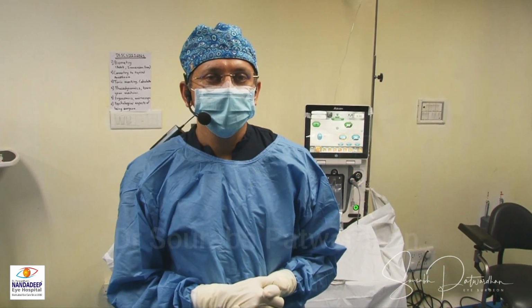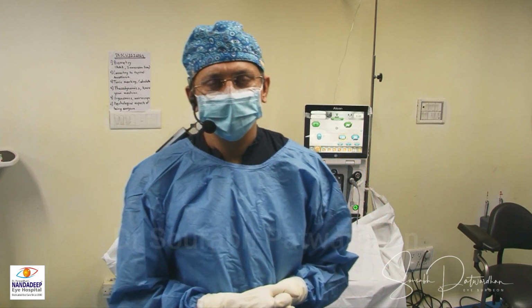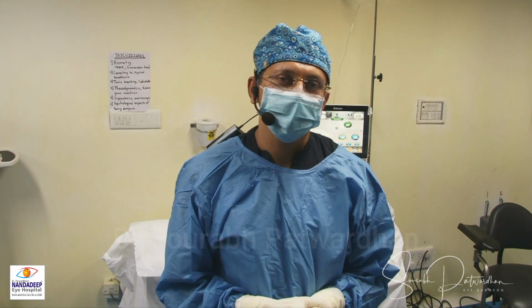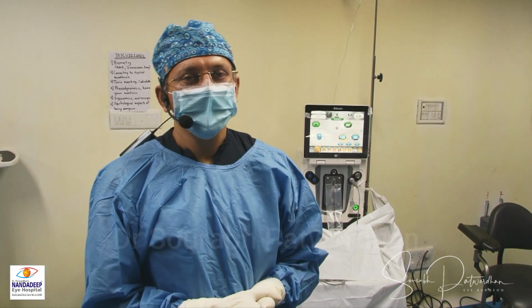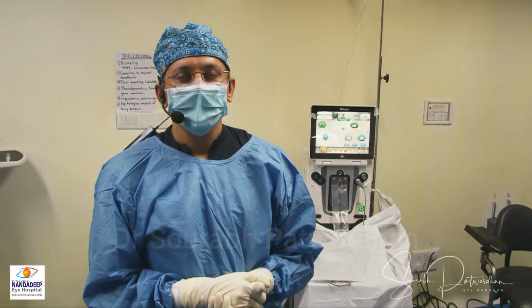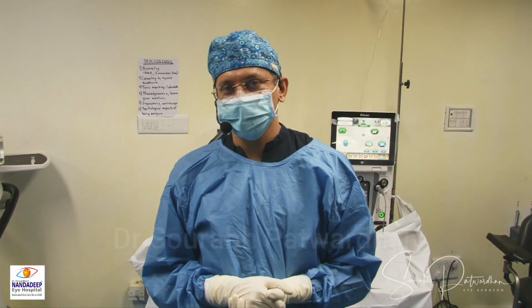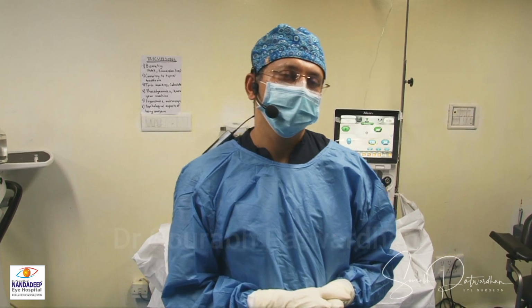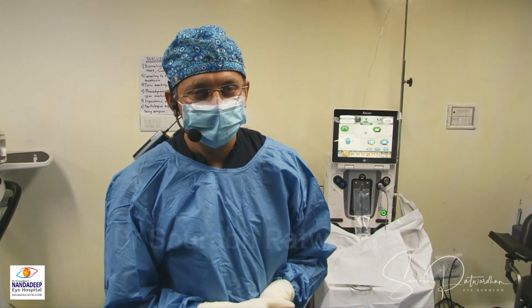It's developed by me, and instead of the usual slit lamp marking or bubble marking, we can use this app very easily in your OT just before the surgery to get the accurate reading. I also have the Callisto markerless system, so we'll also see how much error this has against Callisto, which is more accurate because you don't require to mark the eye in case of Callisto.